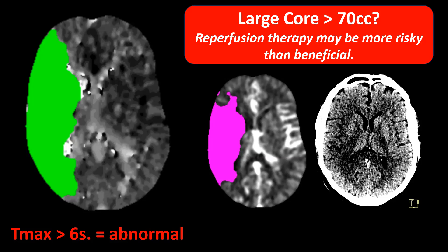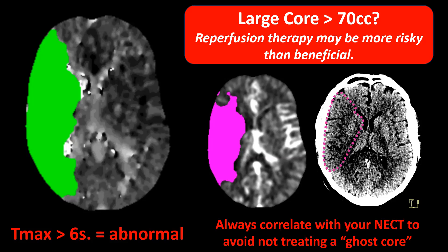On carefully windowed non-contrast CT images, decreased density in the right cerebral hemisphere in the MCA territory roughly corresponds to the ischemic core identified on the rCBF map — and that's basically confirmation that the rCBF map speaks the truth and this is a real ischemic core. If you don't see those changes on non-enhanced CT, you may be dealing with a so-called ghost core — a core that is not real — which we mainly see in patients who present very early, because they have severe changes in cerebral blood flow due to the acute occlusion.